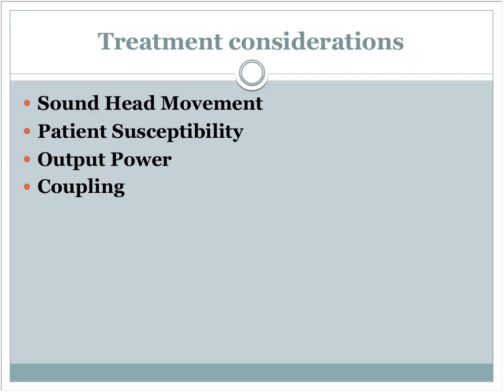The next thing on the list is coupling, and that is the measure of how effectively you're passing the sound waves through a medium to where you want to deliver it. So in other words, your coupling is your gel, okay? So that's your ultrasound gel. First and foremost, don't heat your ultrasound gel. The hotter the temperature, the lower the coupling effect. So all those ultrasound gel warmers that are out there are really detrimental because they're heating the gel up, which is decreasing its ability to then transmit sound waves, okay?